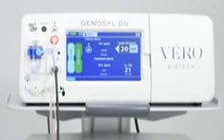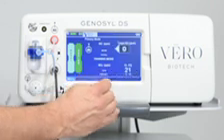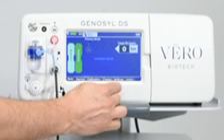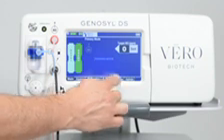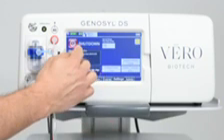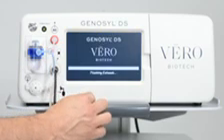When you are finished using the system, follow these steps for shutdown. Ensure the target dose is set to 0. If the Settings tab is not displayed, press the Menu tab to access the sub-level tabs. Press the Settings tab on the display menu. Press the red System Shutdown icon. Press Confirm to shut down.